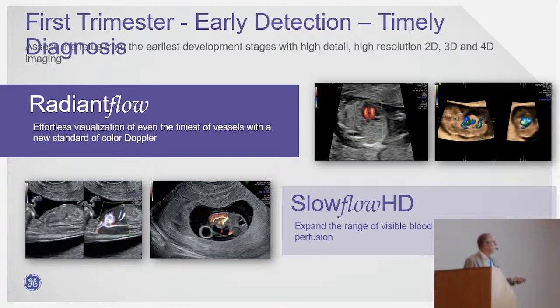So then you need to have a really nice view of the fetal heart in the early pregnancy. And then try the slow flow, because slow flow is really not increasing the mechanical index. So it's very nice. I also got the question, what is this button AO, acoustic output? This acoustic output you can really turn down, then the mechanical index is going down, but your slow flow imaging stays very nice. So try to use this one, okay? That works very nicely. Slow flow, and have a look at the mechanical index.